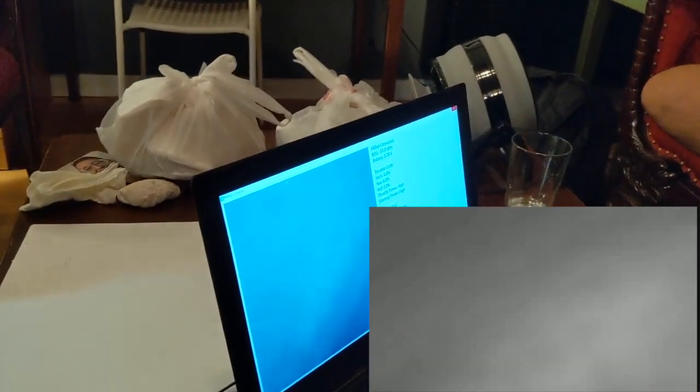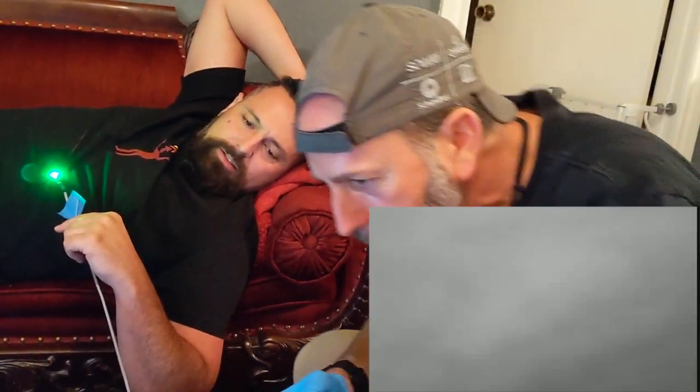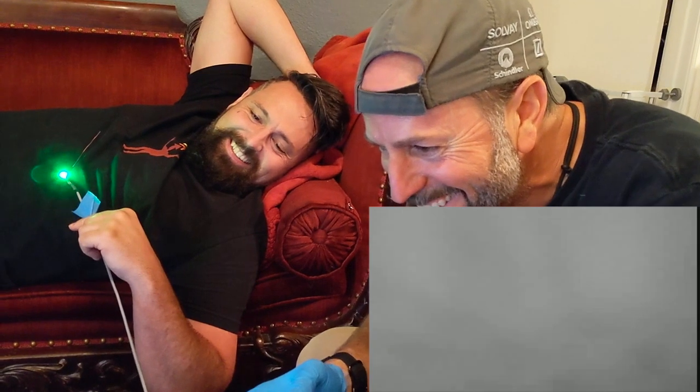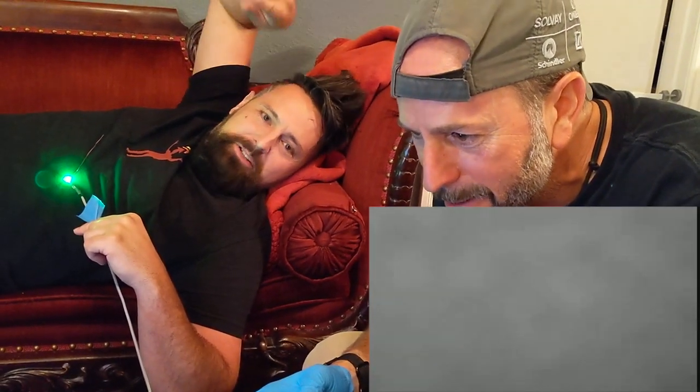Get a little closer so we're at negative 60 dBs on the radio. Alright, I can see some features inside. What is that? What the hell is that? I'm videoing you guys. We've got this thing recording its features. I'm driving around inside Tori's stomach right now.